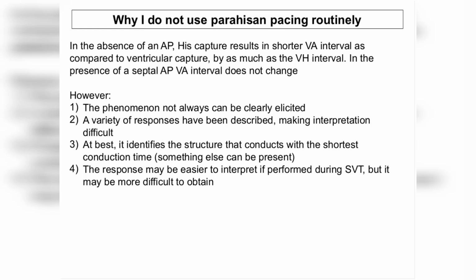And finally, the response, as with the previous maneuvers, is easier to interpret if it is performed during SVT. However, the catheters are also less stable during SVT, and the maneuver is more difficult to elicit during SVT. So, again, this is a trade-off.